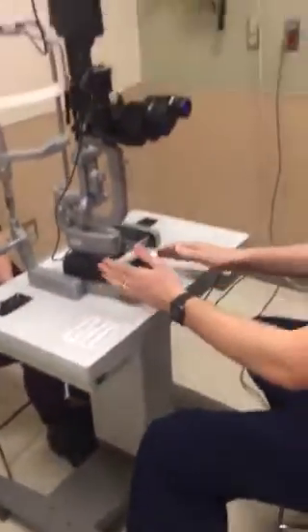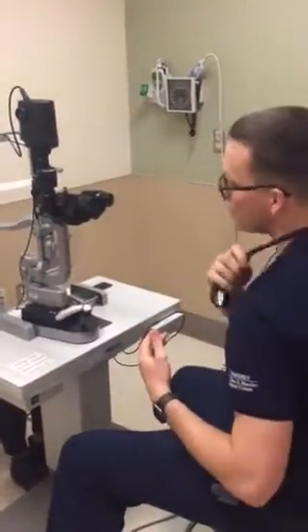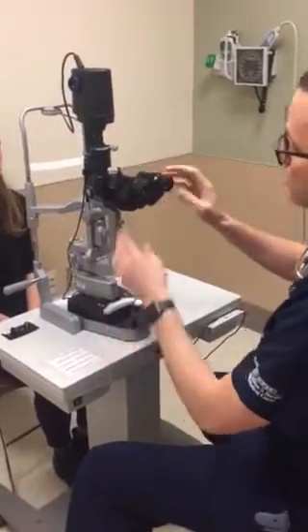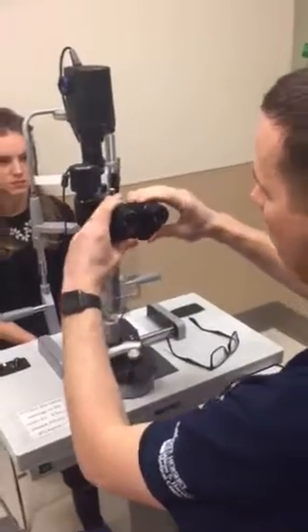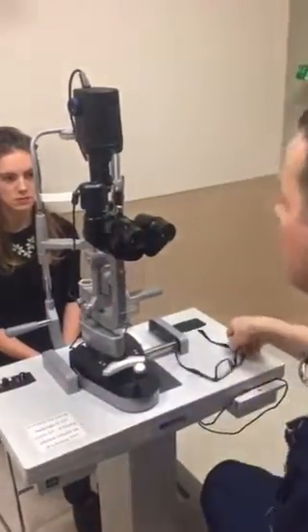Now make some necessary adjustments before you have the patient come forward, just to make sure you're at an appropriate starting point. The first thing to do is adjust the eyepieces to your pupillary distance — these move out and back, so get a feel for what feels right. Next, adjust the slit lamp angle adjustment as well as the microscope, which should be parallel to one another.